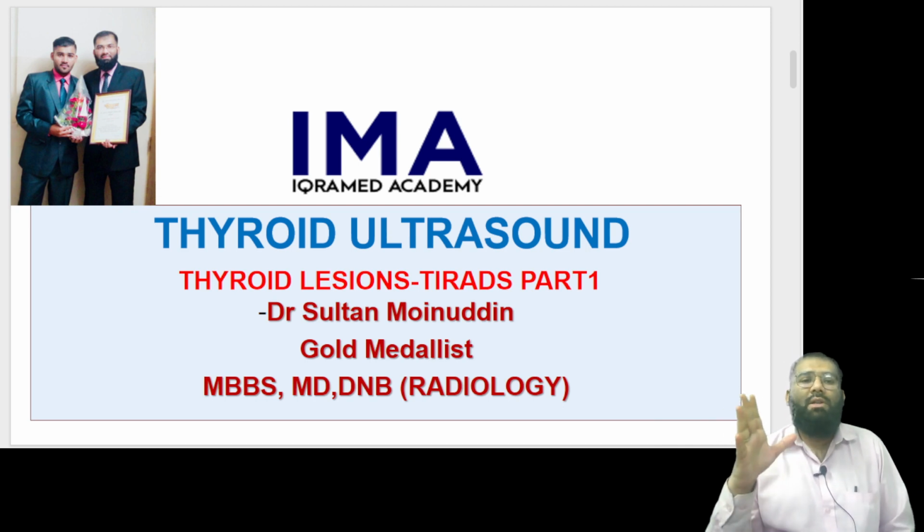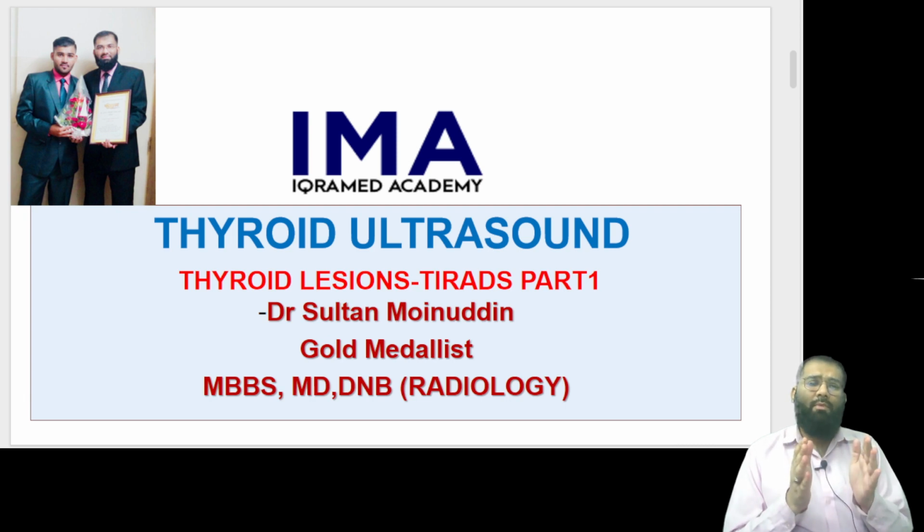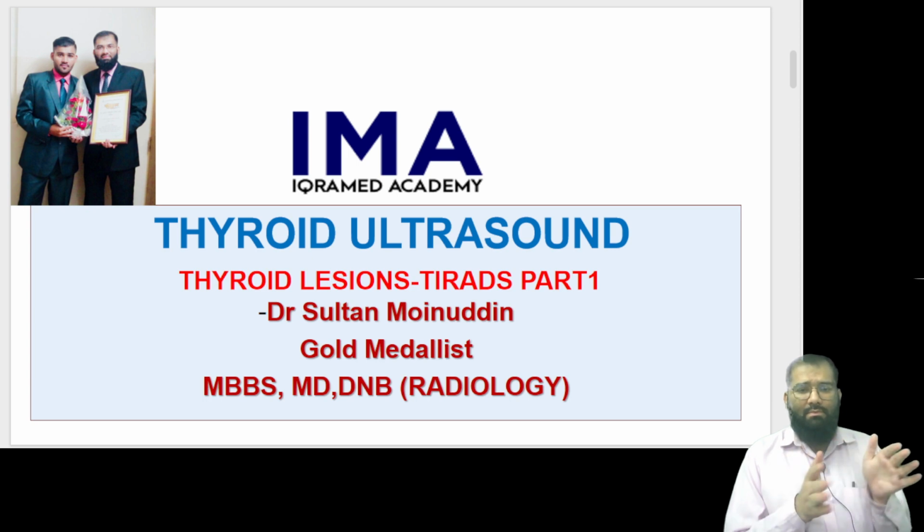We are here in this session to discuss thyroid lesions on ultrasound. When on ultrasound you see any lesion in a thyroid gland, primitively, before there were TI-RADS, people used to give it like likely benign, likely malignant, intermediate, and that doesn't hold true sometimes.